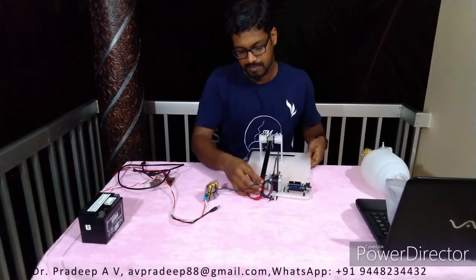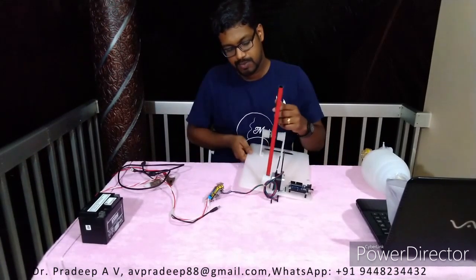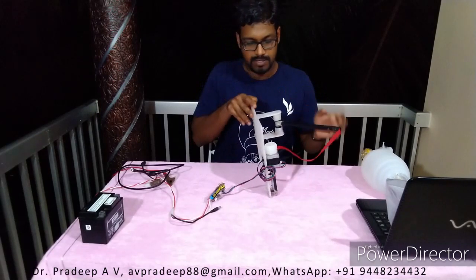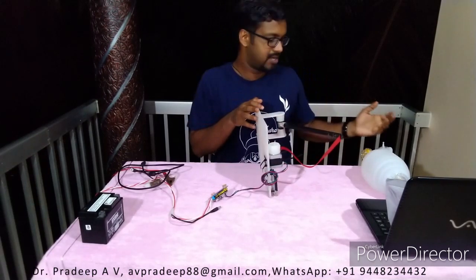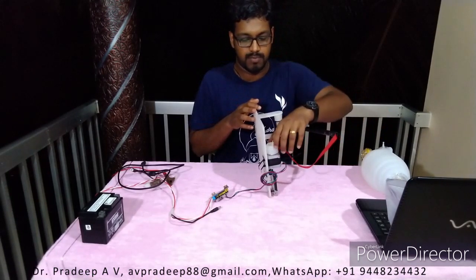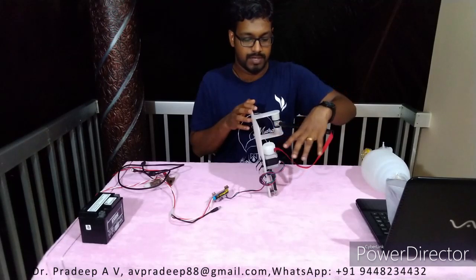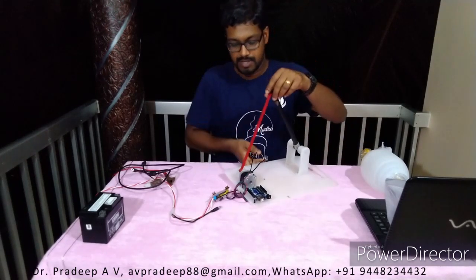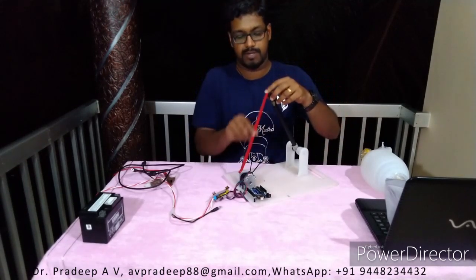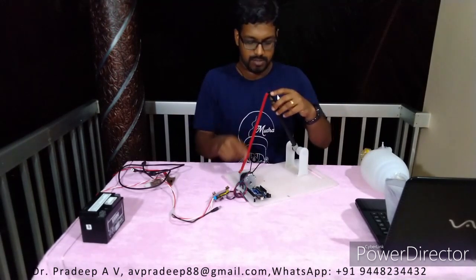This other part of the stepper motor, there's a shaft. And I used some bush, which we generally keep underneath the legs of the wooden table. This is that bush, the plastic bush, which is connected to the stepper motor. There's a ribbon, like the ones we have on this ID card tag.